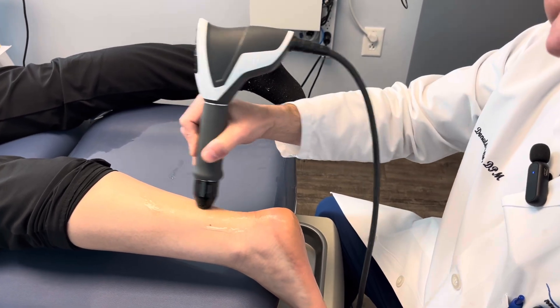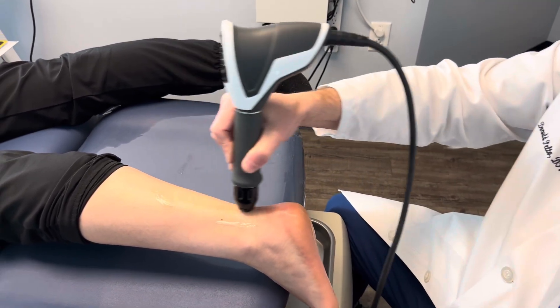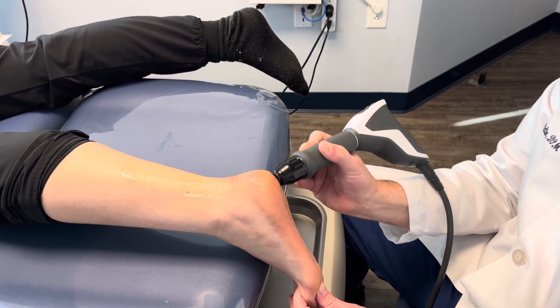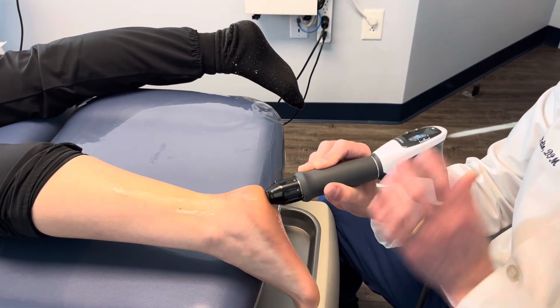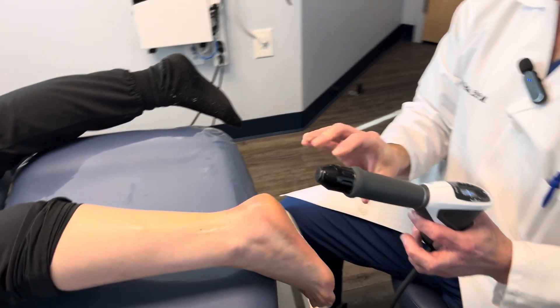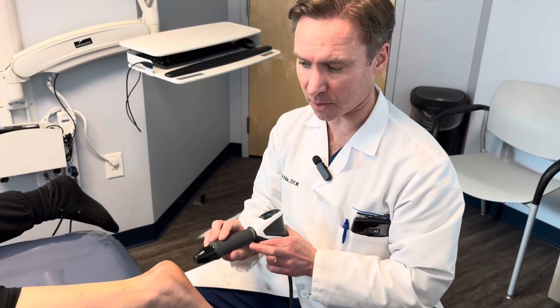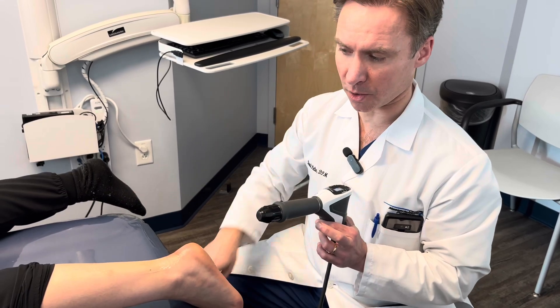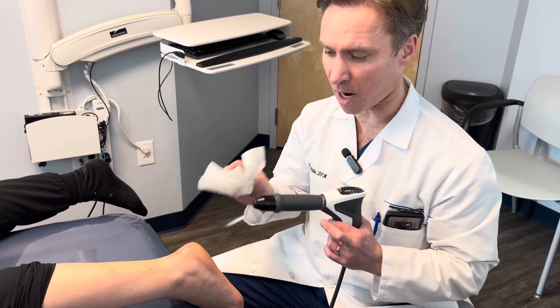Some patients have both Achilles and plantar fascia issues, so you can then come down and treat the plantar fascia on the bottom as well. With radial shockwave, you're doing a bigger surface area — about the size of a dollar bill or your palm — and you're going to use all 2000 pulses going up to their tolerance level.